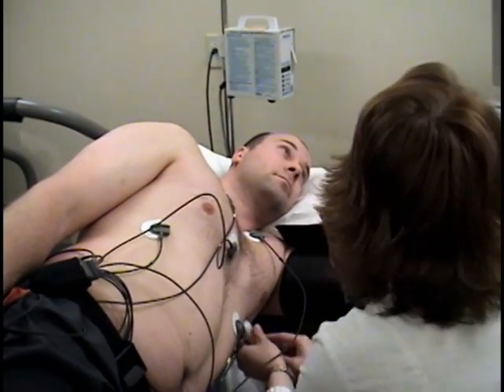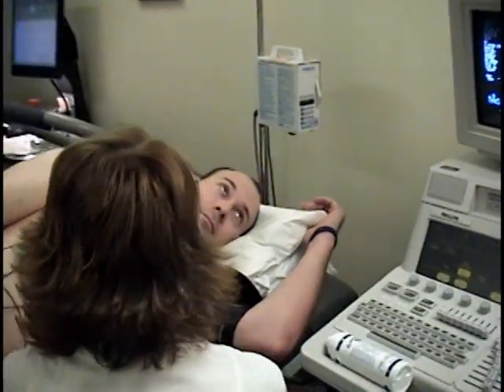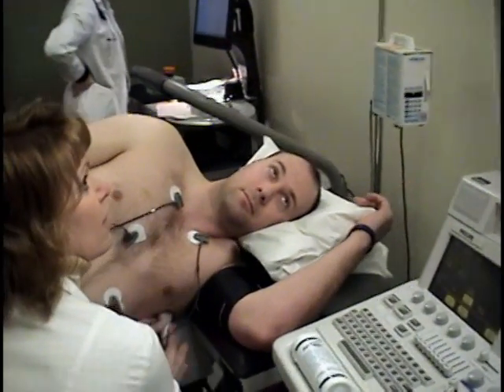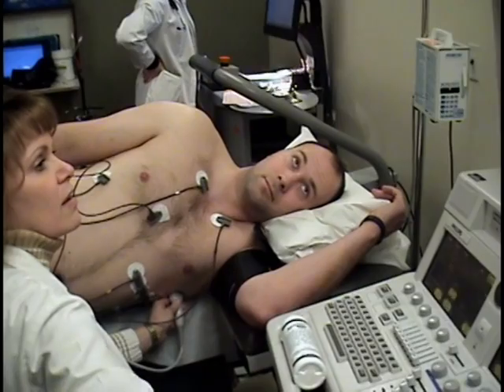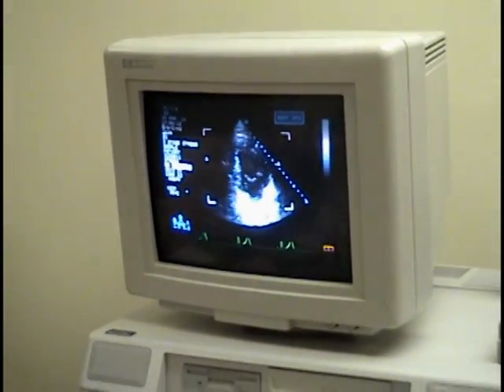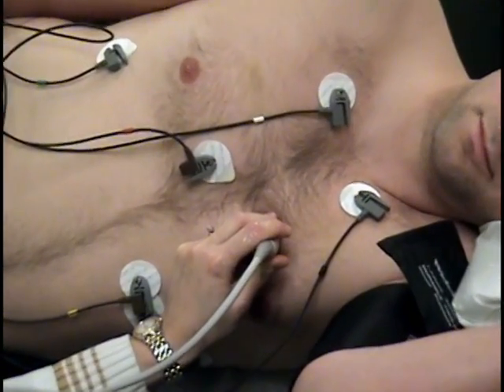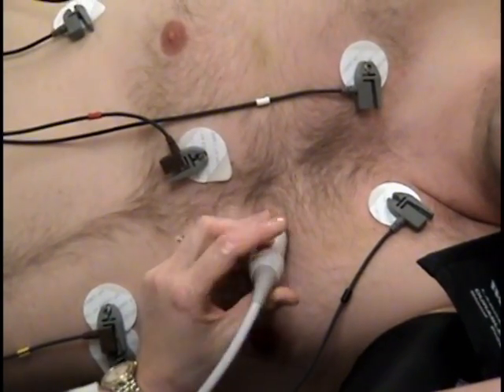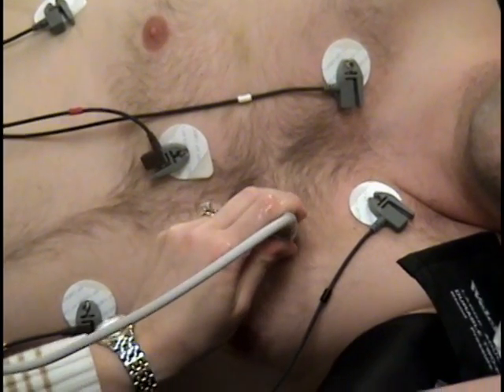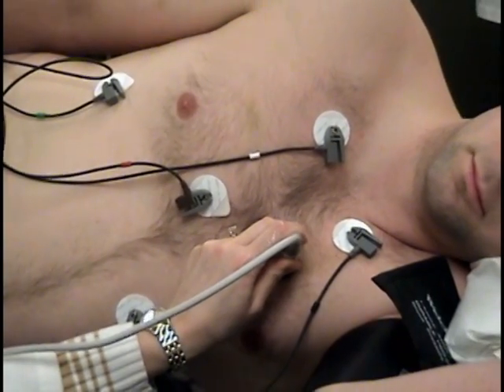One of our sonographers will begin the resting images of your heart by placing a clear warm gel on an ultrasound probe. This gel acts as a conductor, eliminating air bubbles that may become trapped between the ultrasound probe and your body. You may feel varying degrees of pressure as our sonographer guides the probe over your heart to collect the necessary images and measurements.